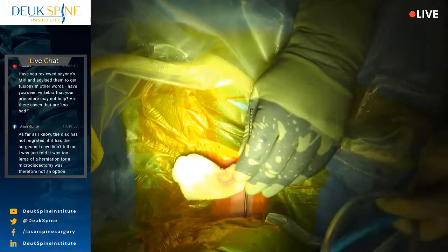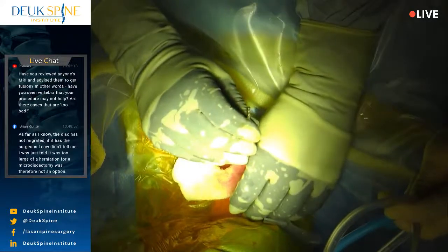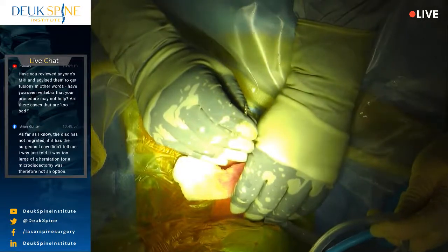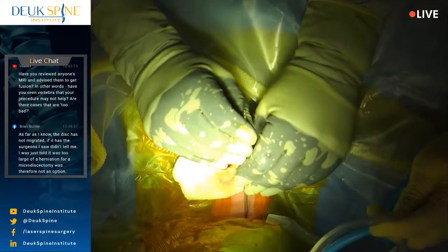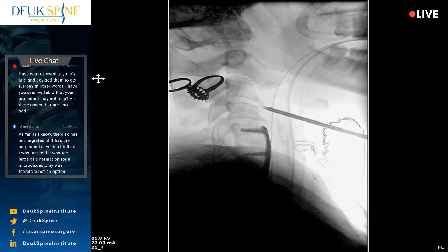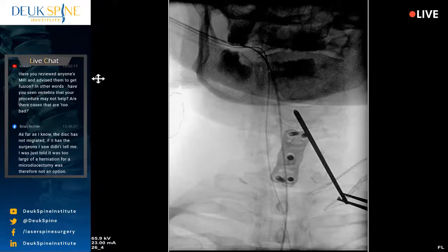I need to be a little lower. Shot. That's better. AP. Poker. So again, I'm just positioning my tool to where I can enter the next disc safely in the middle. That looks good. I'll just aim it a little to the right.